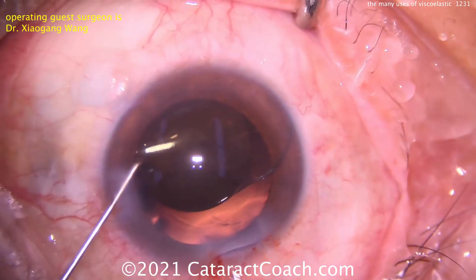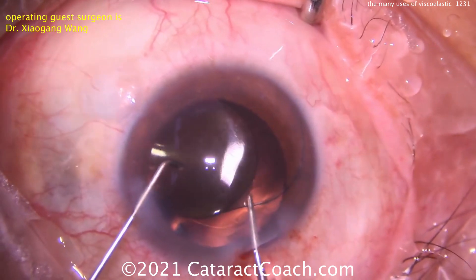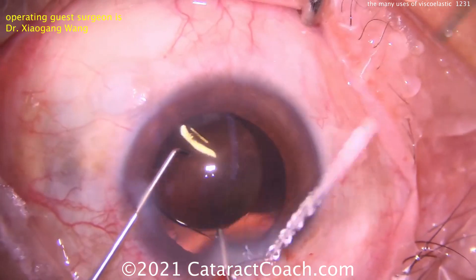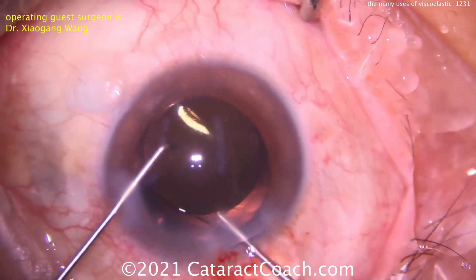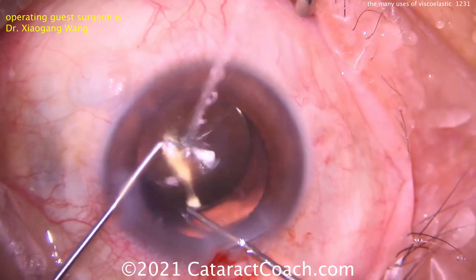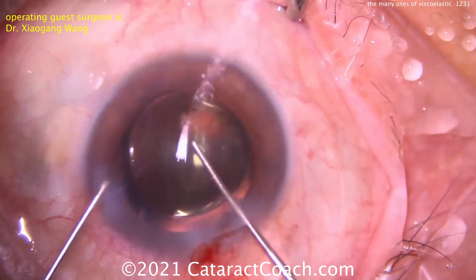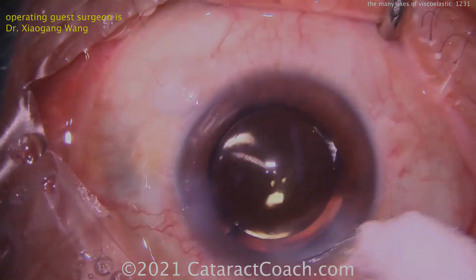Going in through the side port has one more advantage, and that's to fixate the eye. But now the hook's going in the main incision. The nice part is it's small and it doesn't burp the incision as much — you don't lose as much viscoelastic. So taking your time here, remember who told you: viscoelastic is cheaper than vitreous. So if you need to, go ahead and put in more viscoelastic — it's always the better option. And there you go, now the lens is in the bag and we are happy.